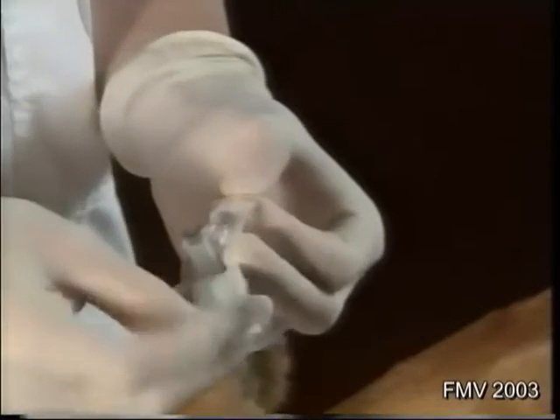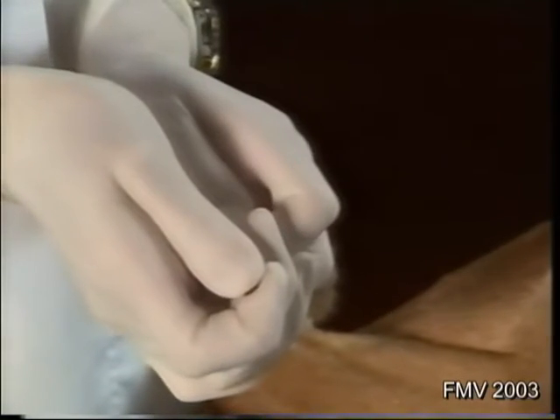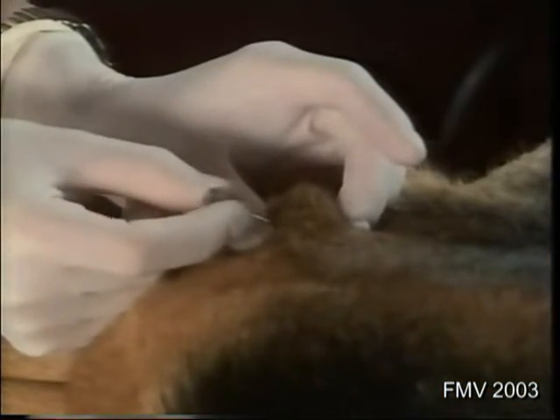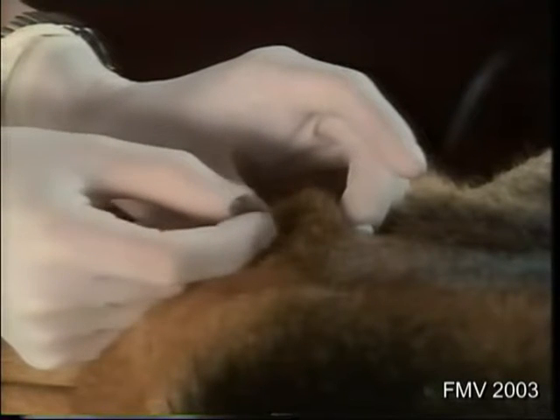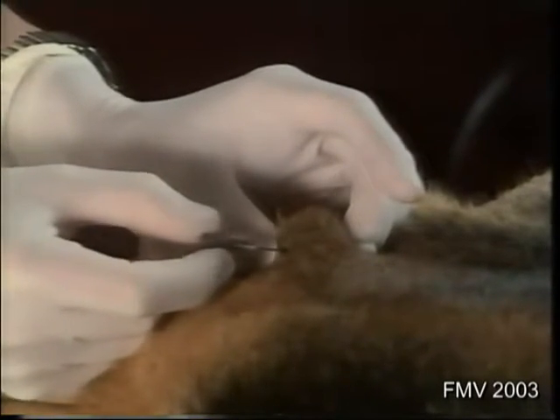The most crucial step in obtaining a sample of adequate cellularity is to ensure that a sufficient number of passes are made through the tissue with the needle. Once the needle is inserted into the mass, move the needle quickly back and forth at least a dozen times. This allows cells to be collected into the needle tip. Turn and reorient the needle and repeat the passes.